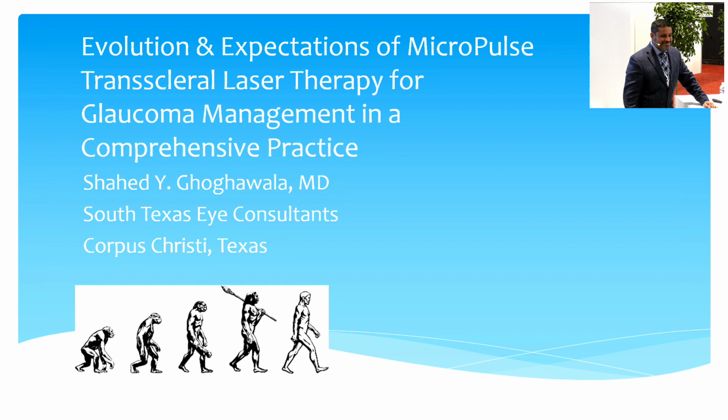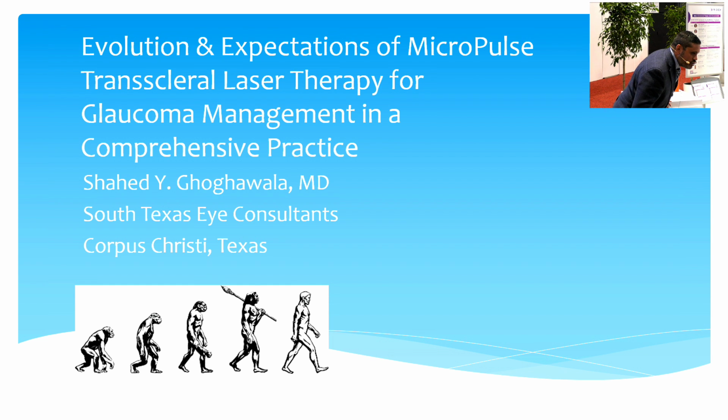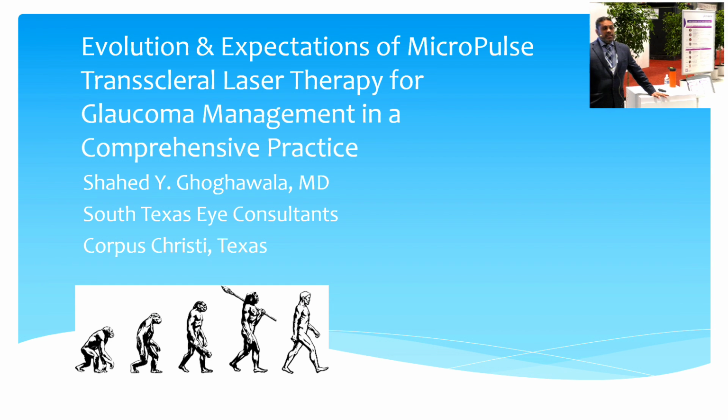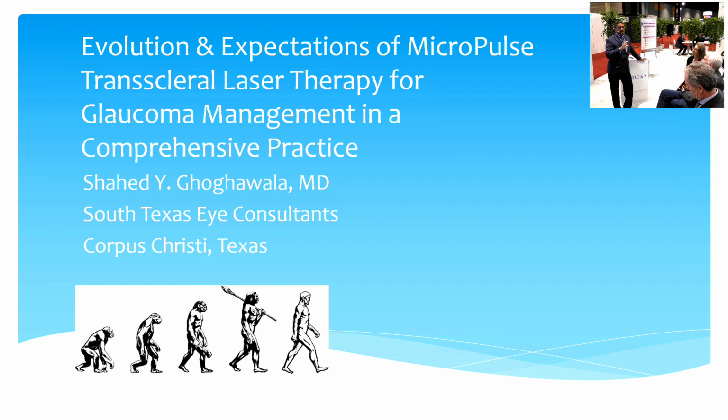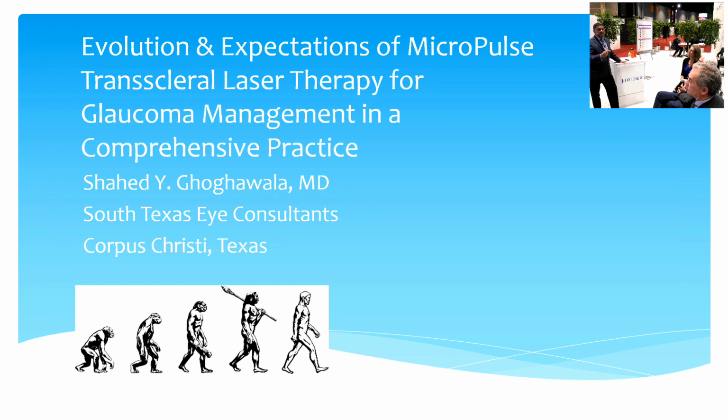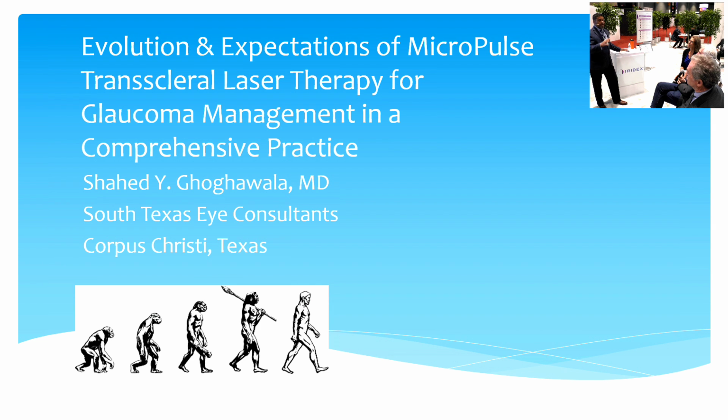And what are the limits of the time and the power? What are the limits? Yes. So, like I said, I think that right now our upper limit for the duration per quadrant is about 70 seconds. That's one thing you can modulate. You can then modulate your power from 2,500 all the way up to 2,700, and that's kind of the parameters for that. You can mix a little bit of those two, and then lastly, you can slow down your sweep velocity, and that can also provide you with improved efficacy without increasing your power or duration.